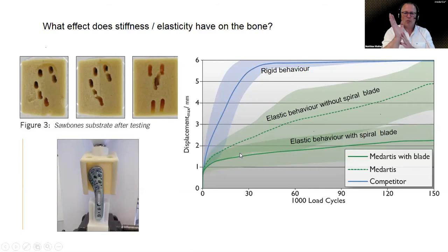But since the implant was more flexible, those forces were not compensated by the plastic itself; a certain energy was stored in the deforming energy of the implant, as elastic or flexible deformation. When you took the load off, this deformation was fed back to the system, which means it acted more like a spring, like a suspension in a car, rather than a bicycle where every bump from underneath is directly converted, bang, to your saddle, so you get it directly into your spine. You can actually feel this. If you have a suspension, then certainly you have lots of deformation there. And that's something you can actually see. Even after 150,000 cycles with this system, we just about reached 5 millimeters.